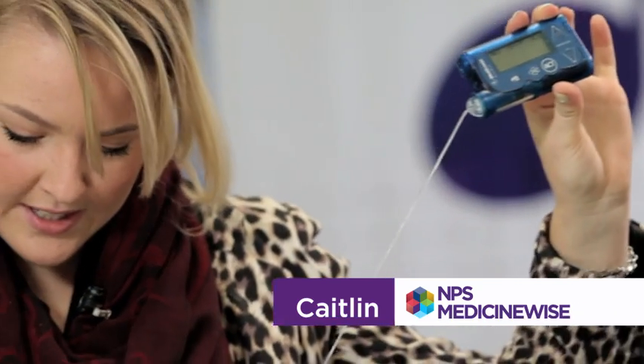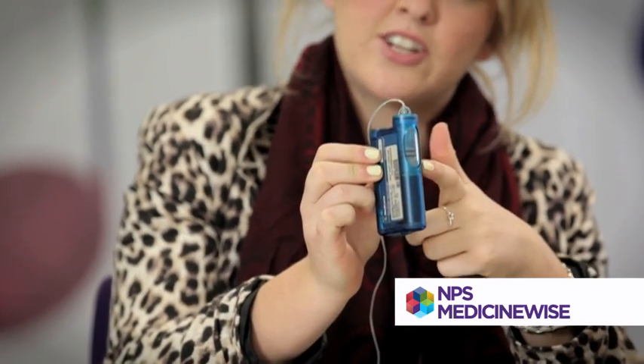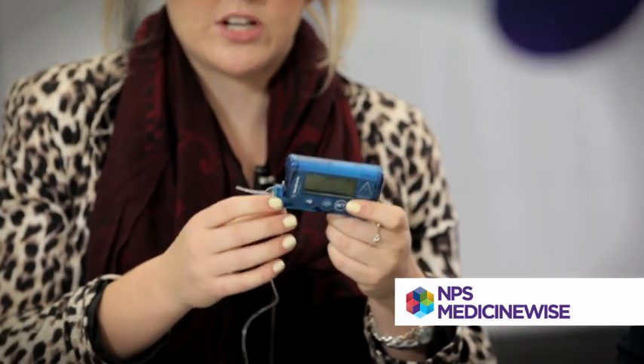It's just like a little mobile phone, about standard size. Tubing goes down into my stomach. The insulin sits in there in a little cartridge that you change every three days or whenever it runs out. It'll give you a warning saying the insulin is running low, so change it over.